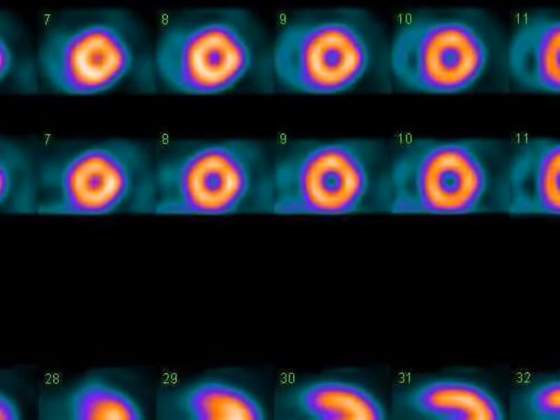So as you can see, the left ventricle, inside where the little circle is, this is actually the cavity of the heart. This is where the blood's going to sit. So this would be the short axis view that we're looking at. This wall is the septum, this wall is the lateral, this is the anterior, and this is the inferior.